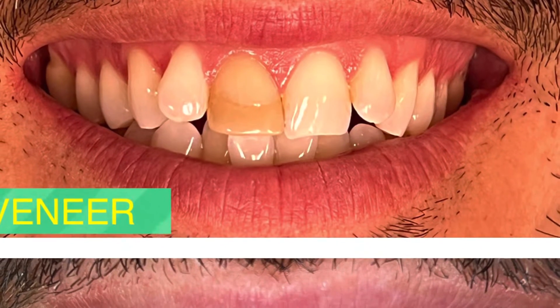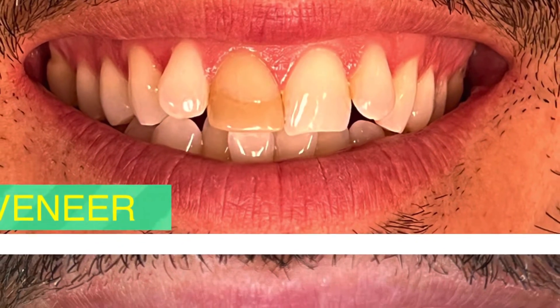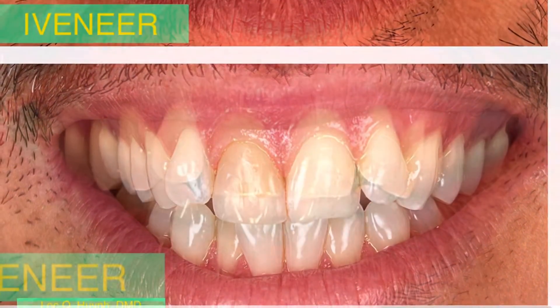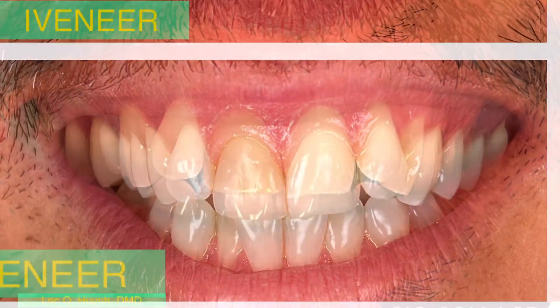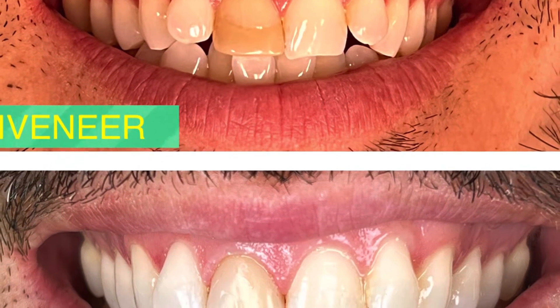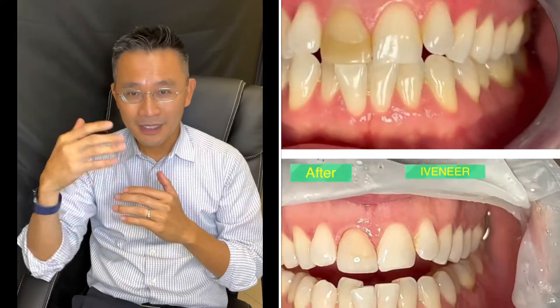You only have about an hour or less to work with — this is a turnaround case — so you need to spend enough time and make sure you remove all the stain. That's how you get a better result. I really made a mistake and I just want to show you so that for your future iveneer cases you know: it's a very thin layer, so you have to remove anything that you think could potentially appear through your new veneer.